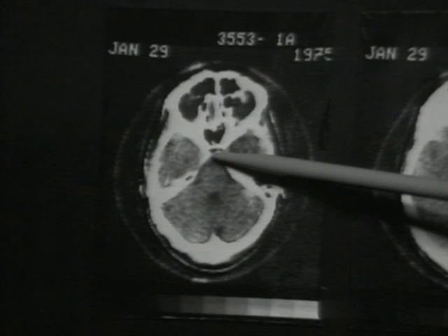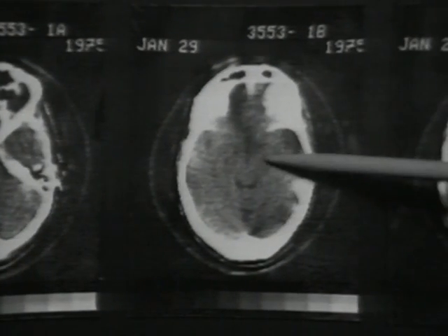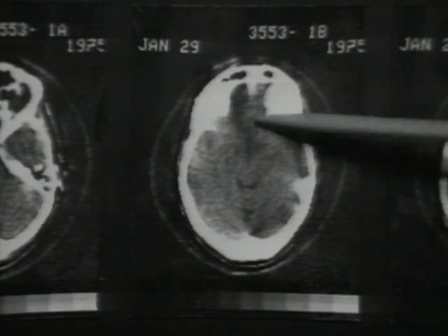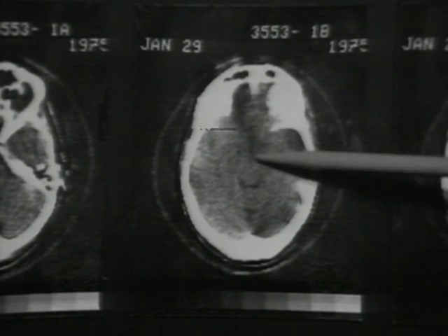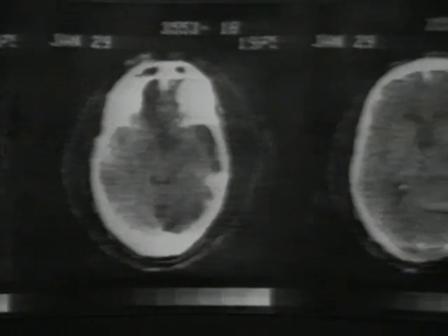In the posterior fossa, we can see the fourth ventricle, the brainstem, the pontine cistern, and the lateral extensions into the cerebellopontine angles. Coming to the next slice up, we can see the quadrigeminal cistern, we can see the thin slit of the third ventricle, and the sylvian fissures situated more laterally in the temporal fossae.